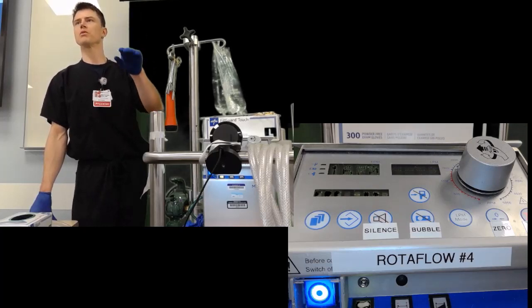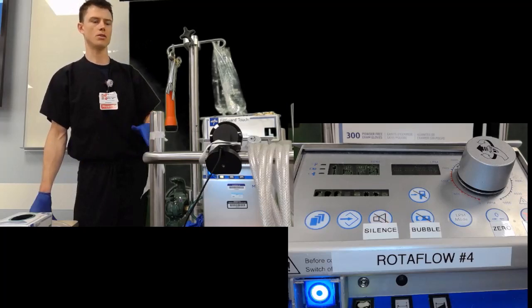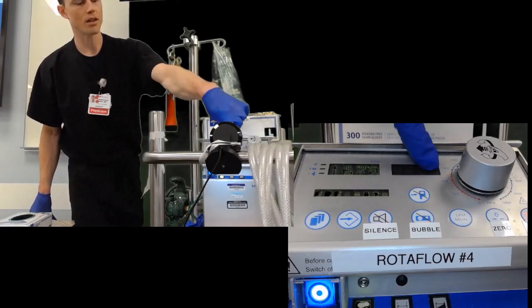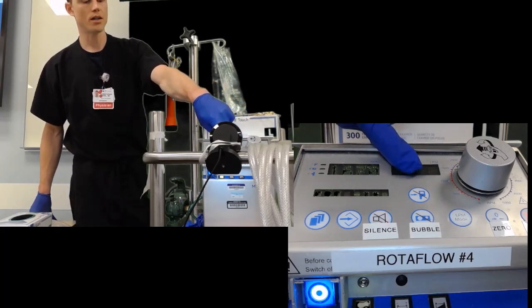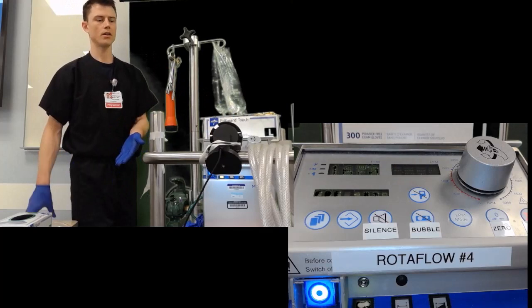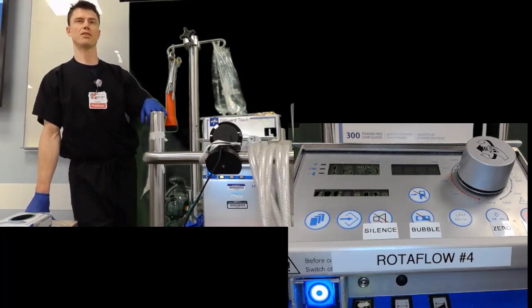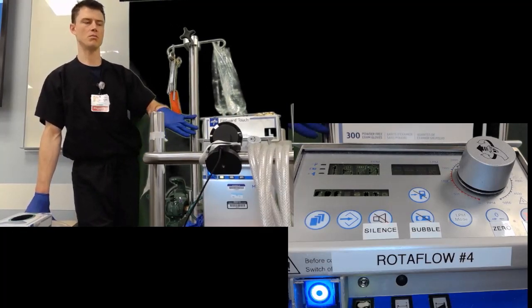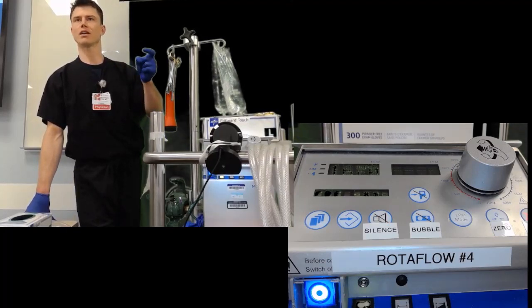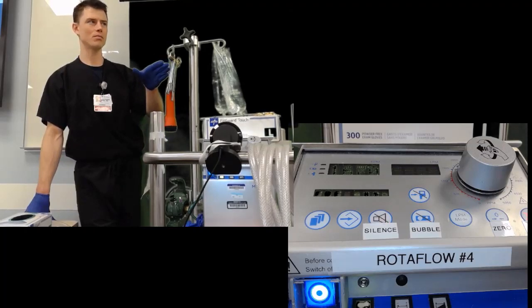How much blood flow is occurring is based on the resistance of the circuit and patient, et cetera. Right now it's reading a flat line, like it's not reading a flow. That can be because things aren't pumping, or it can be for another nuanced thing about this specific machine that we should be aware of. It's that the sensor is not detecting any flow. It's actually out of gel to sense.